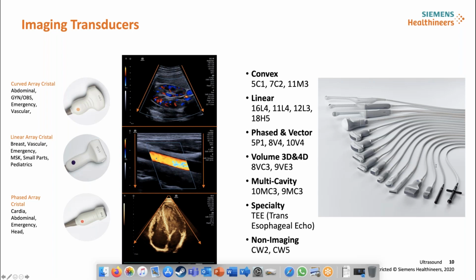Next question, there are a lot of questions actually, it's very nice. What are the differences between using CT and ultrasound in detection, and which one is the most helpful? This is a bit the same as before. I would say it depends on the patient, on the availability and all this. They will basically do the same thing. CT will help a bit more, maybe for difficult cases to see a bit better, but it will be harder to use, harder to clean, maybe not available, maybe hard to move the patient. So in the end, the doctors will choose which one is best for that patient, but they can both do very well.